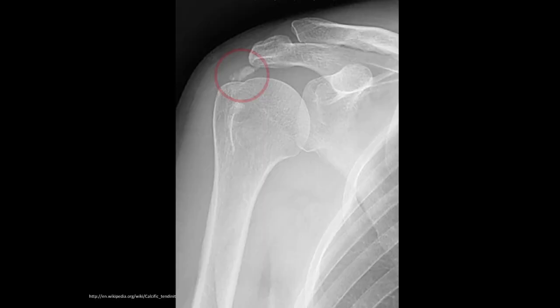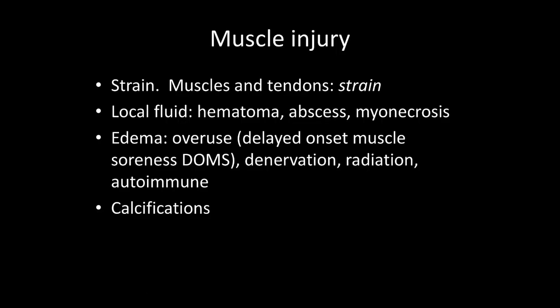Here we have calcific tendinopathy or tendinitis of the distal supraspinatus — I can say it's the distal supraspinatus because that's where I expect it on this external rotation image of the shoulder. You can actually see a lot here: the biceps longhead tendon, the lesser and greater tuberosity, and the intertubercular groove between them where the biceps longhead tendon lives. Normal alignment of the bones. When talking about muscle injuries that are not a frank tear, we're talking about a strain. Muscles and tendons strain; ligaments sprain. That's the correct terminology.